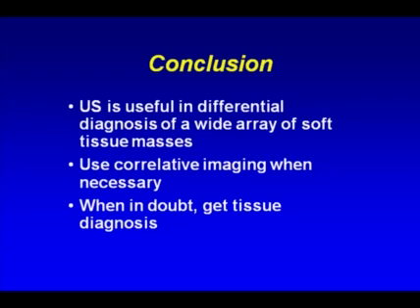Okay. So I hope that at least in this lecture I've given you a framework when you are presented with a patient with a palpable mass on how best to evaluate the mass to at least narrow the differential and to guide subsequent procedures, either diagnostic or therapeutic.